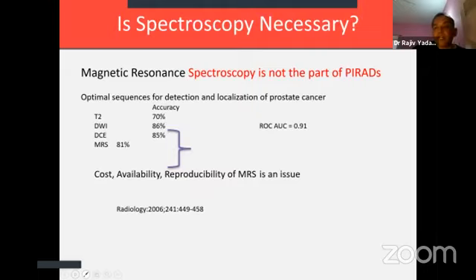I would urge the practicing urologists to specifically not write MRS. It is still very commonly being used. Maybe there are other pressures, I'm not sure about it. But if you believe that MRS is really helping, I'm telling you it doesn't really make a difference.